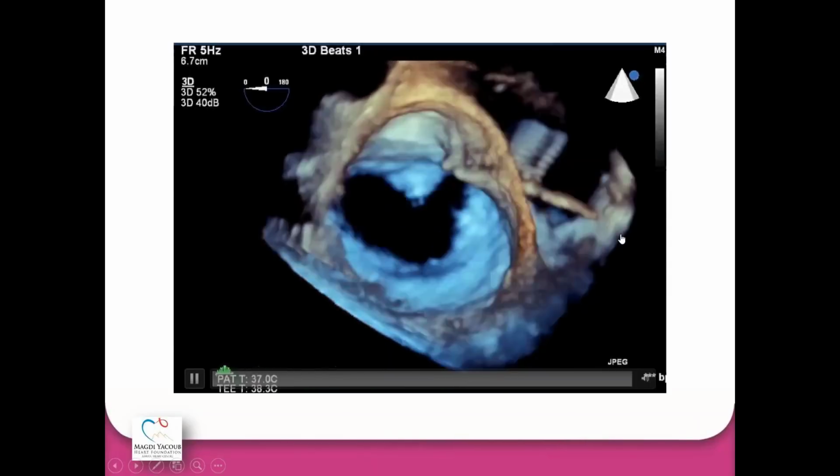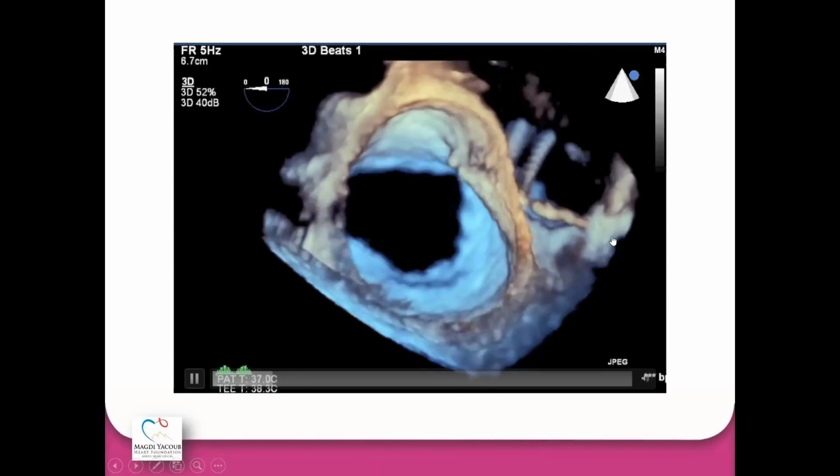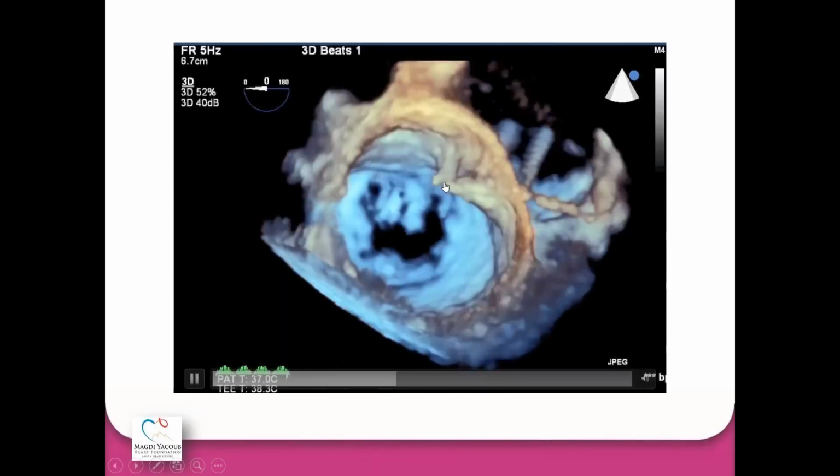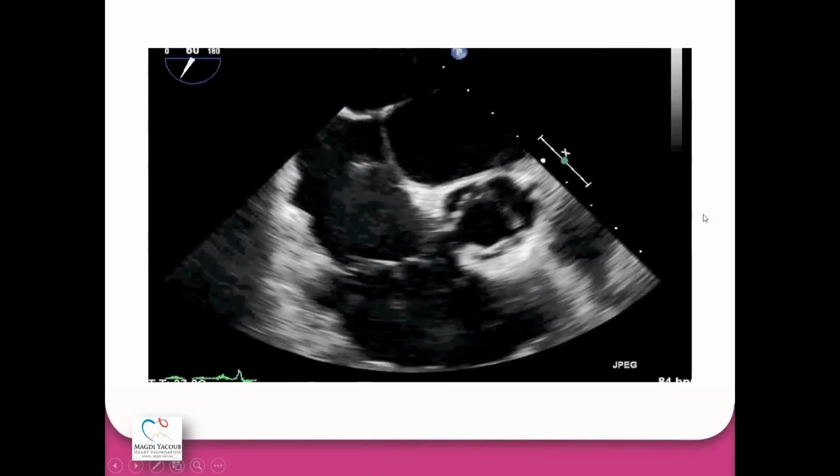Usually use a 3D zoom, because this is the live mode of acquisition that helps you to monitor live events in the cath lab. You can see the catheter is coming from the right side, tenting the septum, mitral valve is down. You can see everything from one view.